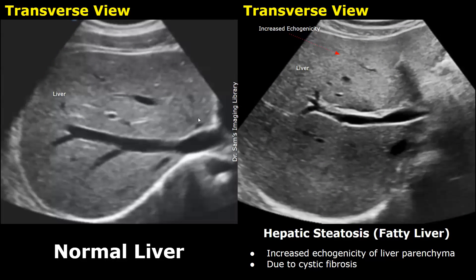This is a normal image of the liver in transverse plane in a child. Here we have a fatty liver case — hepatic steatosis — where increased echogenicity of the liver parenchyma is seen with some sparing in this region. This was due to cystic fibrosis; in children, fatty liver can occur due to cystic fibrosis.